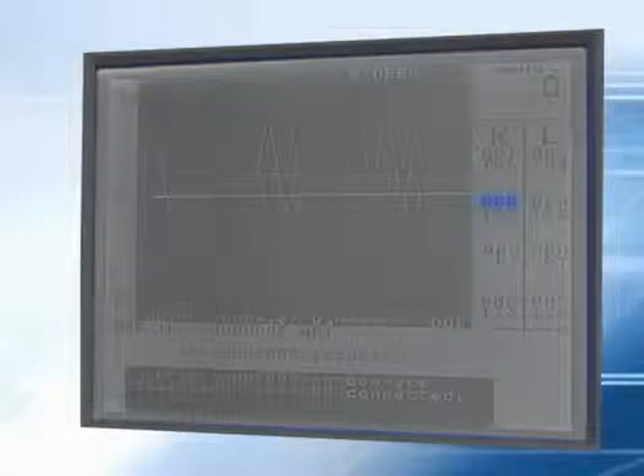Step-by-step instructions are located here below the date and time stamp. The right side of the display provides information on the pressure and which site you are at in the exam. This area represents a patient lying supine on an exam table. The standard ABI protocol is set up for the exam to be performed in a horseshoe fashion. The protocol marker moves from site to site as you progress through the exam.